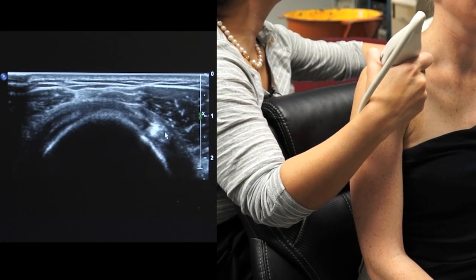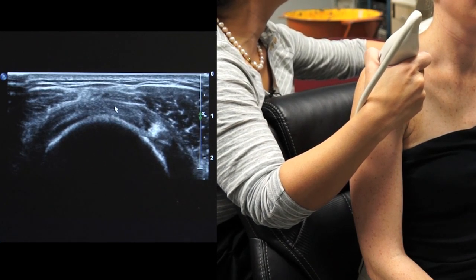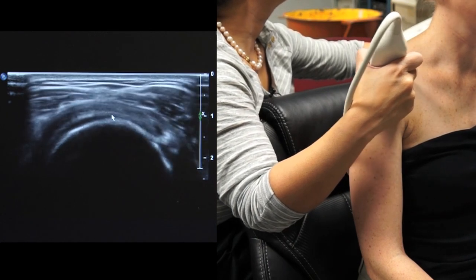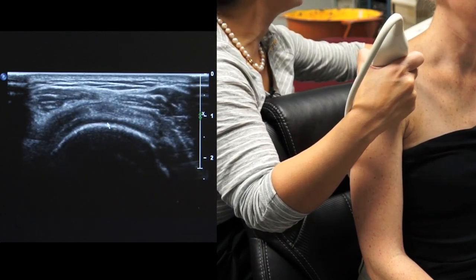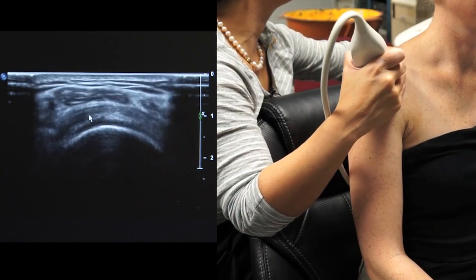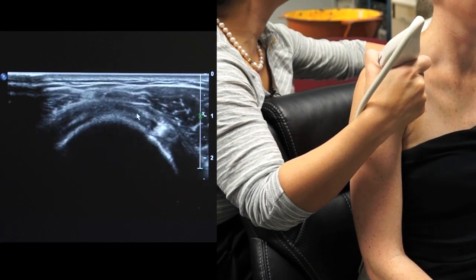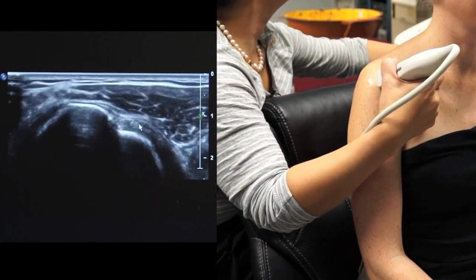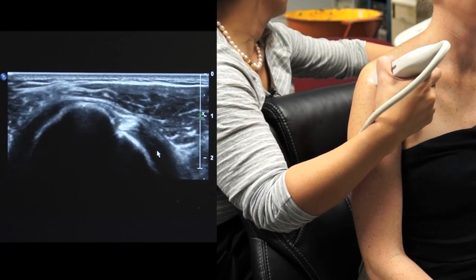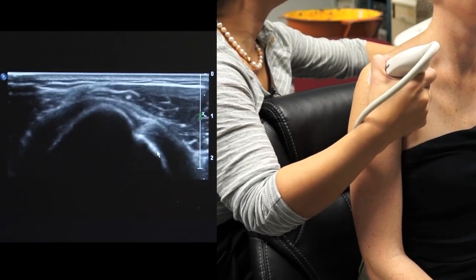Now, just to show you here, this is the biceps tendon. So we know that lateral to that, we will be seeing the supraspinatus. And then as we slide, we don't have a clear demarcation, but we know as we go further, we will be looking at the infraspinatus and teres. So infraspinatus, supraspinatus, biceps tendon, which means this is the subscapularis. Okay, so that's the rotator cuff.